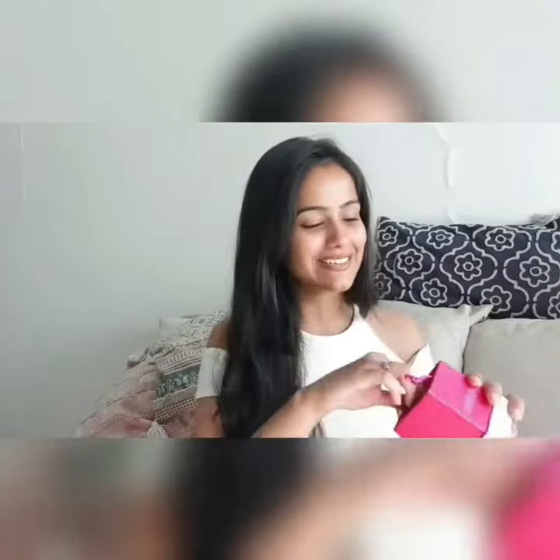Hi guys, so I am here again, this time to talk about the second product that Everteen has sent me. Now this is a menstrual cup. Let me quickly show you everything about this.